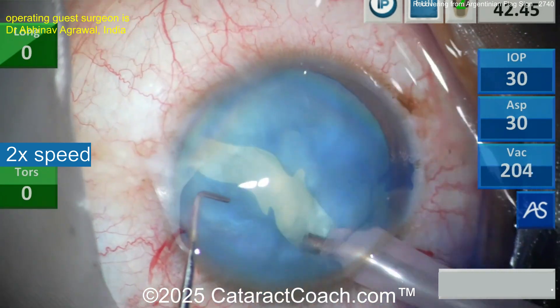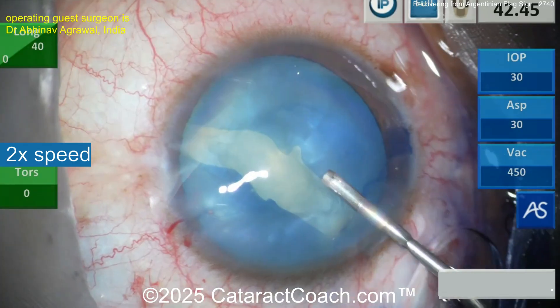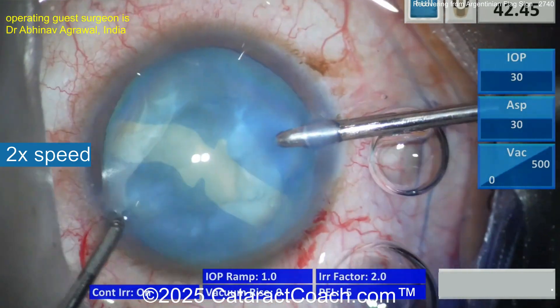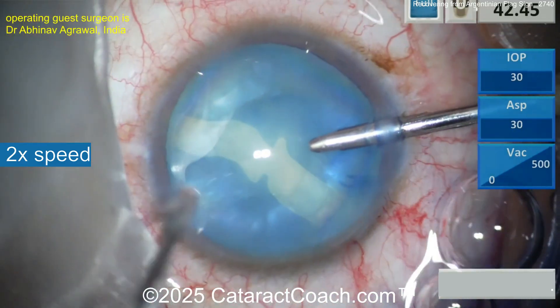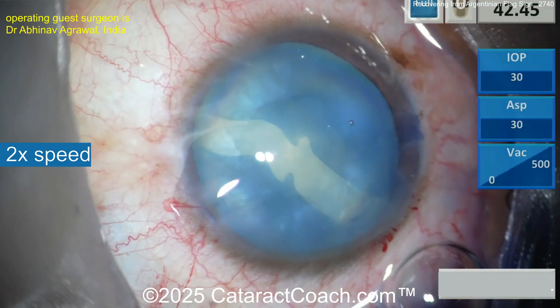We've talked about so many different ways of doing this. We've talked about how to depressurize the capsule bag, a YAG laser, phacopuncture, Zepto and Femto, needle decompression — all these things we've talked about. They can definitely help if you do some of these techniques, but I have not found one that's 100% perfect just yet.